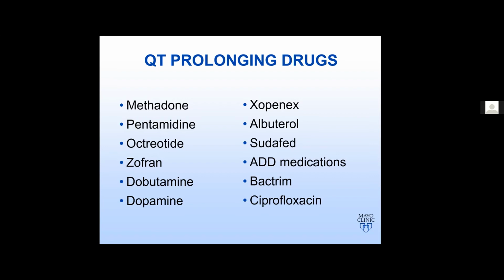In addition, what about sports screening? Well, currently in the US, doing routine ECGs before sports screening is not recommended. There's many different things that go into that, but once again, because of the number of false positives and the need to restrict patients, it's not recommended, because the incidence of having a positive ECG finding, like I said, is about 10 to 15%, but the incidence of actually having something that's dangerous or life-threatening is only about 1 in 2,000.